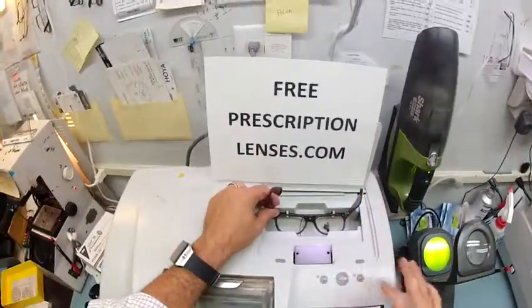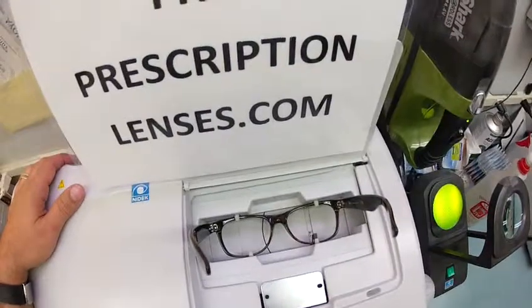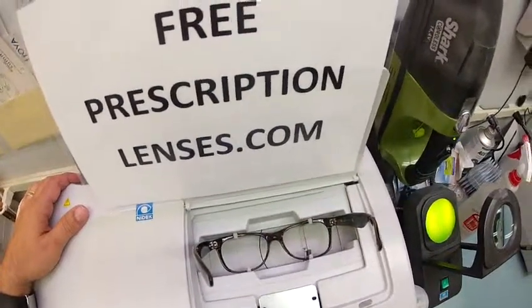I'm going to put your Italian frame into my Italian Santinelli LE1000 patternless edger, and the stylus is going to come up and trace the shape of your right lens, and then it's going to move over and trace the shape of your left lens.